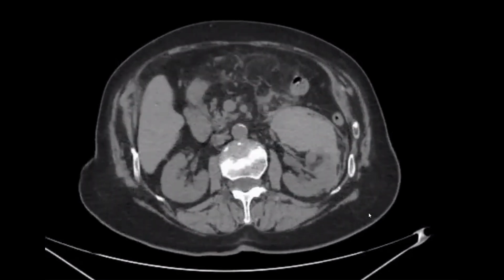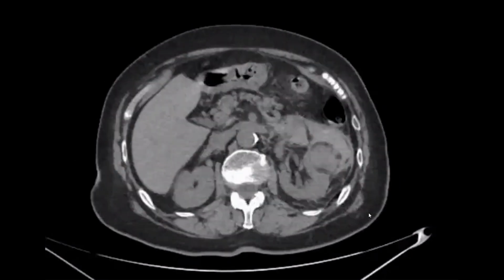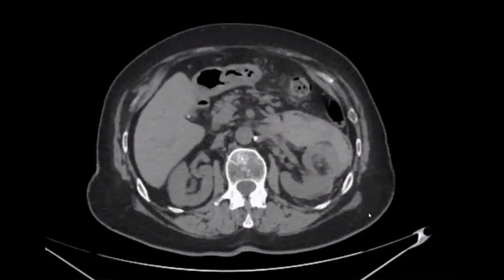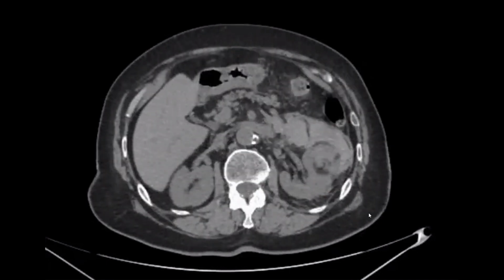As this is an emergency, I will pick up my phone and inform the referring physician or suggest referral to the interventional radiologist for urgent embolization. Also, after stabilization of the patient, I would like to look for the stigmata associated with the disease. If this is a case of tuberous sclerosis, I would like to see the heart for rhabdomyoma. Yes. Very nice. Also the lungs. Very nice that you showed the examiner that you are searching for any associated findings that support a case of tuberous sclerosis in case we have angiomyolipoma.